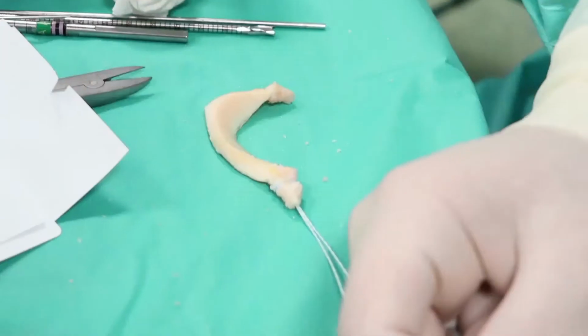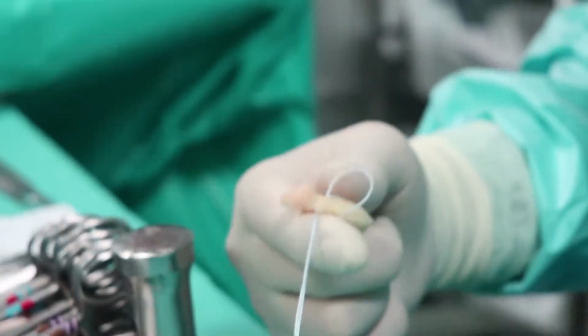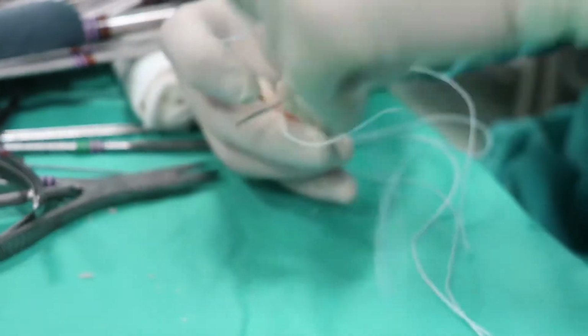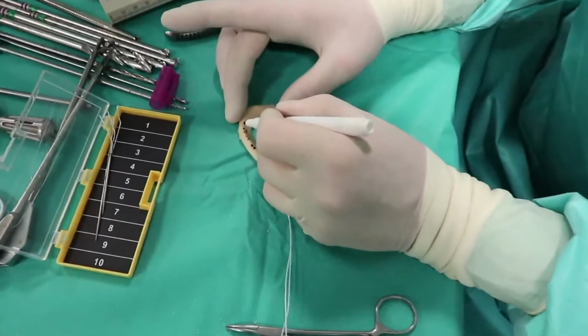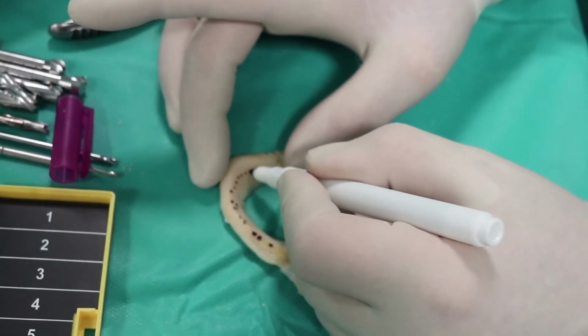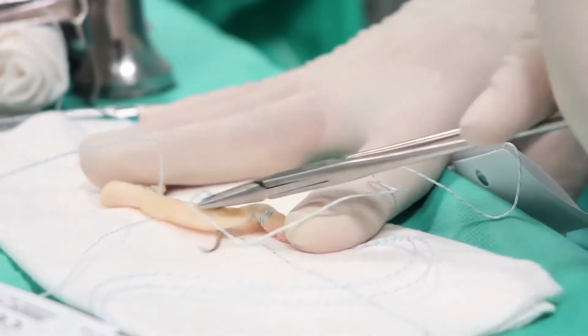The innovations on the technique that we're presenting are several and important. First, this is an arthroscopic technique. Second, we use preloaded meniscal sutures because it allows a perfect vertical placement of the stitches that incorporate the entire height of the meniscus to the capsule. Third, the use of bone plugs. This is not a new feature, but the combination of these three characteristics hasn't been reported before.